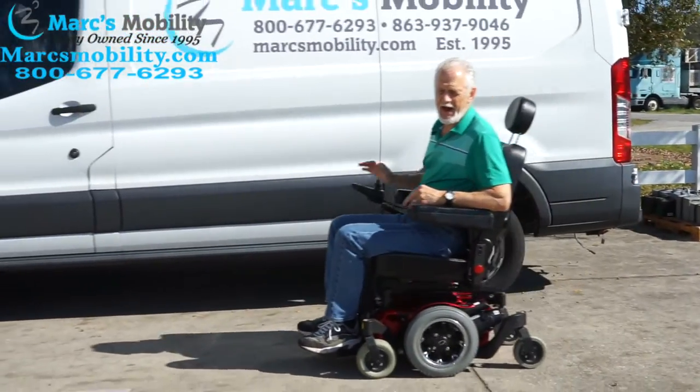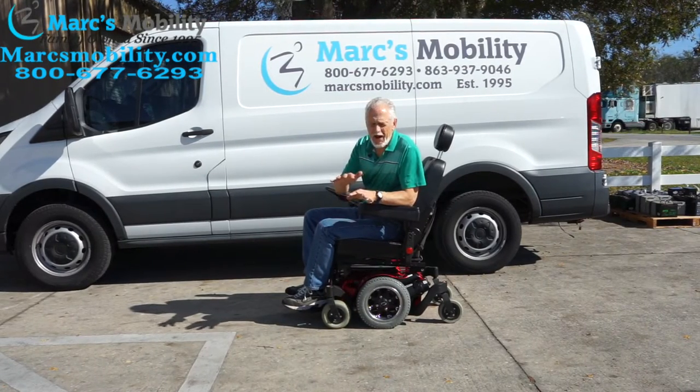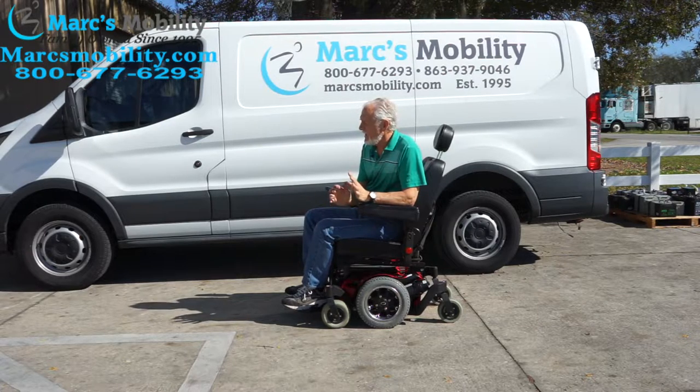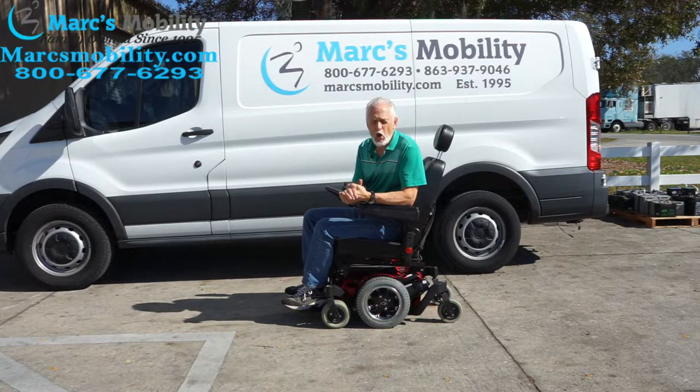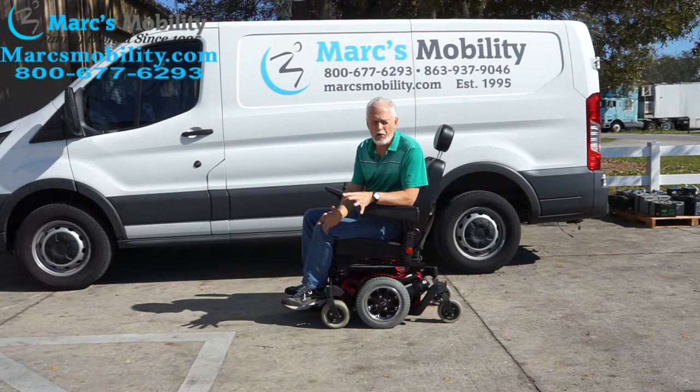This chair doesn't care if it's on grass or concrete — it goes the same speed as long as your grass has a good bottom. This chair has great suspension, so you should have no problem at all.